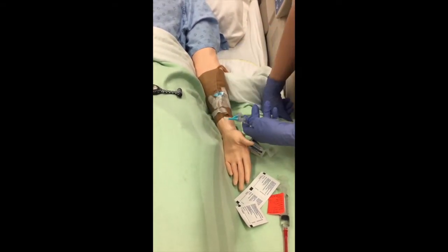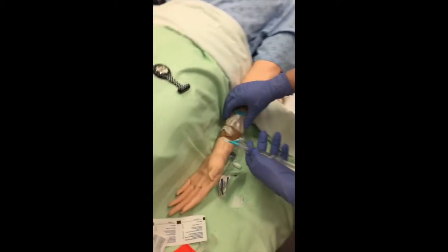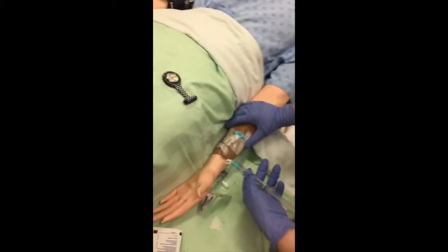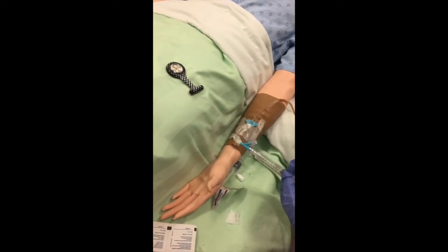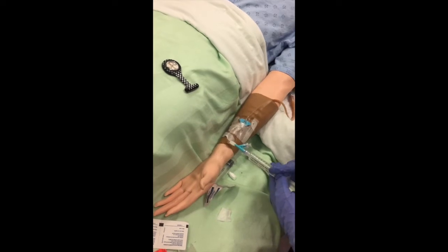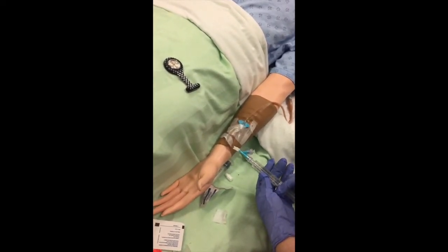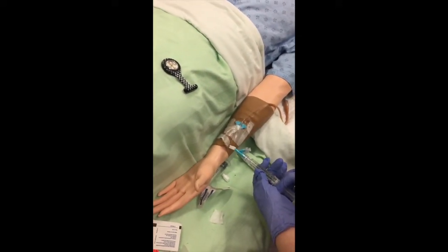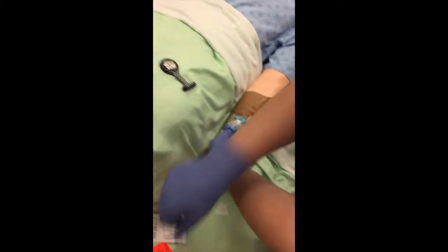I'm also assessing for signs and symptoms of infiltration, so any edema at the site, any coolness and swelling, any pain at the site. Saying no pain. So that's perfect. So I'm going to aspirate back a little bit, and I'm getting blood return, which is good. So now I'm just going to flush it a little bit. So I'm going to instill a little bit. It goes in well, no swelling is occurring, and then I'm going to push, push, push, and then that is all good. This is patent.